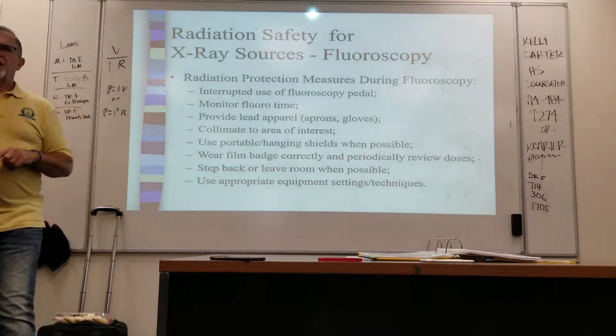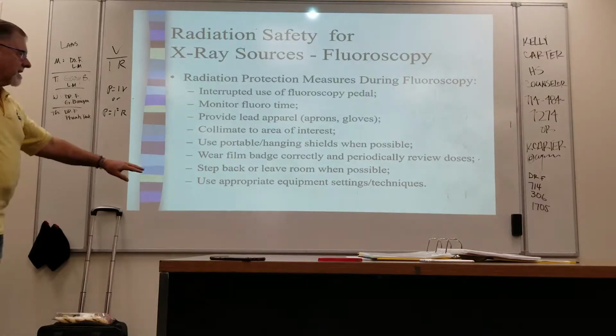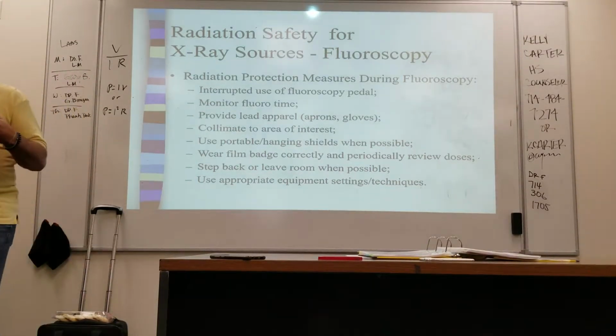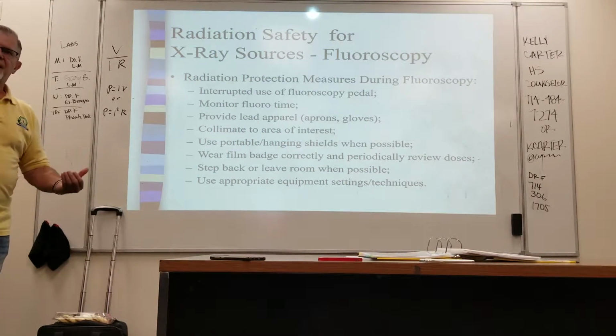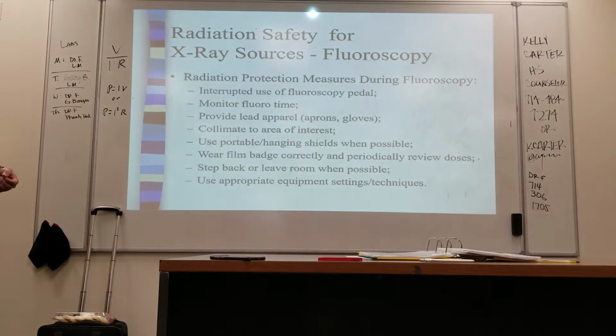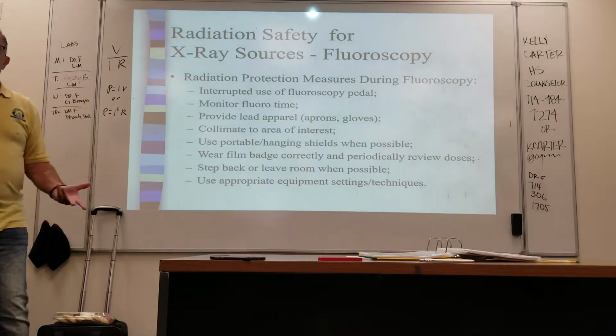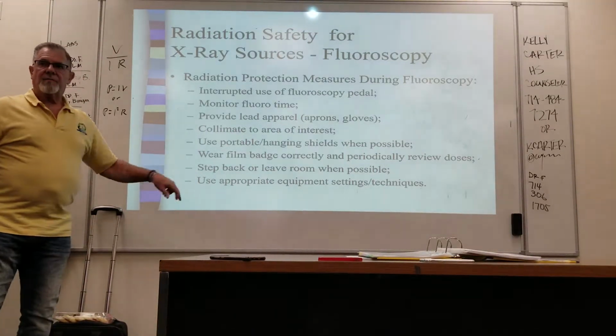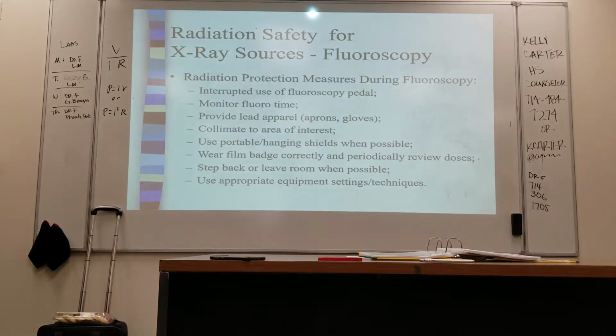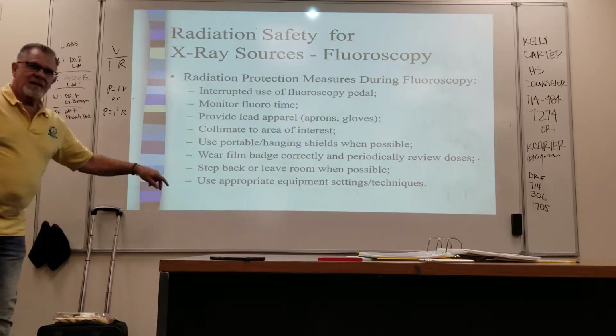This is on us. This is a technologist thing. It's really up to the technologist to understand the equipment, go through that operator's manual page by page, ask questions, and on a new piece of equipment, try to get them to include you or at least somebody in the manufacturer's training, and that can act as a train the trainer type thing. But you're going to be the person that people ask questions of. Once the manufacturer person leaves, you're going to be it. You become the expert. Okay. This saves patient dose.